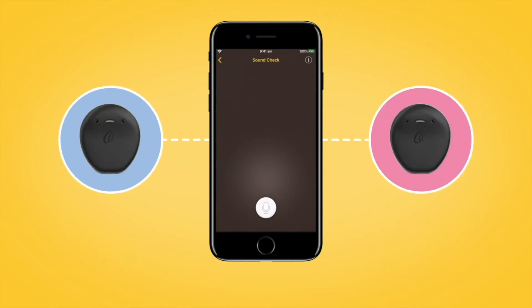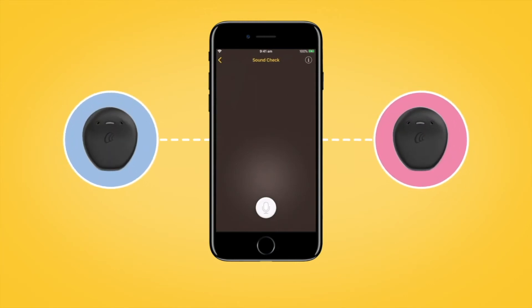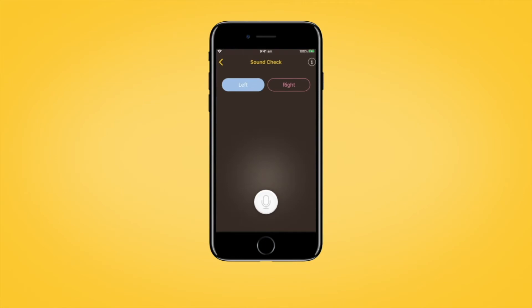If you have two sound processors, the left one will be selected when you open Sound Check. If you want to select the right sound processor, tap the right processor select button.